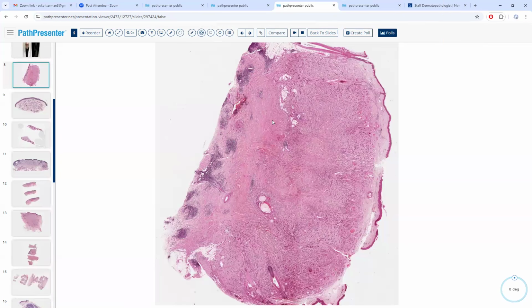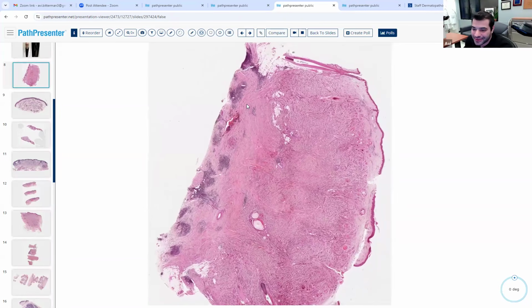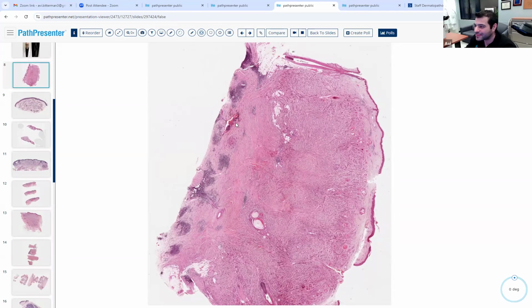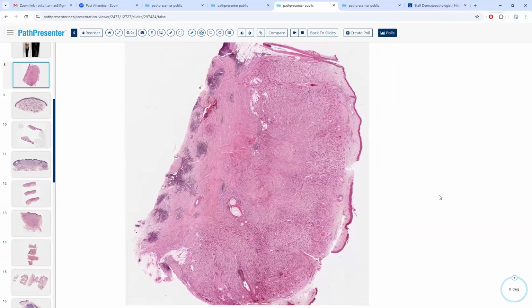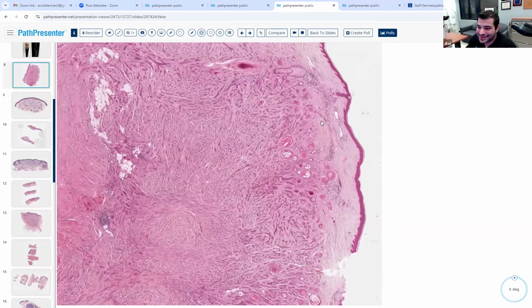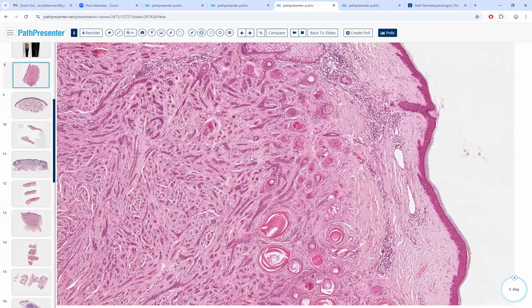Lymphocytes, probably. And why are you saying lymphocytes as opposed to histiocytes from this power? Looks more black. Yeah, jet black on low power, probably lymphocytes. So you have these conspicuous aggregates of lymphocytes. What about the size of this tumor? Large. Yeah, it's pretty large. And you mentioned there's paisley tie. Do you see the paisley ties now? Yeah, closer.